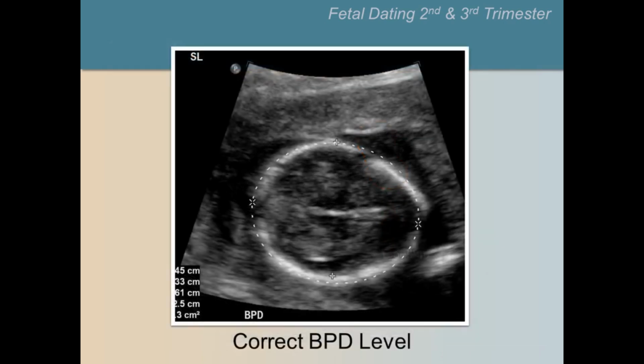This is the correct level to measure the BPD. We cannot see the cerebellum at this level. Notice the correct placement of the calipers to measure the biparietal diameter, one on the outer and one on the inner edge of the skull.